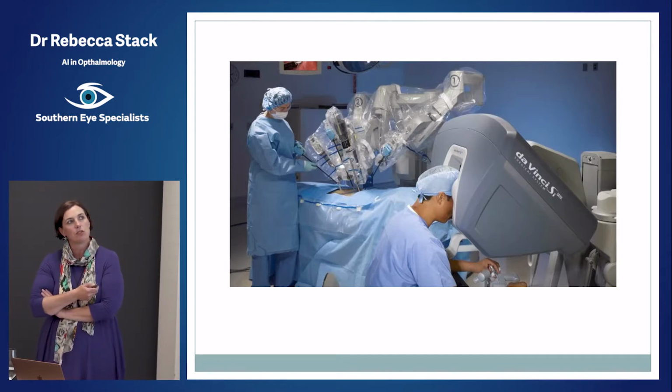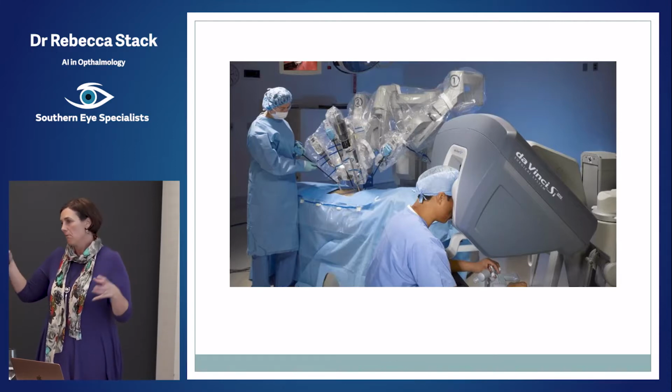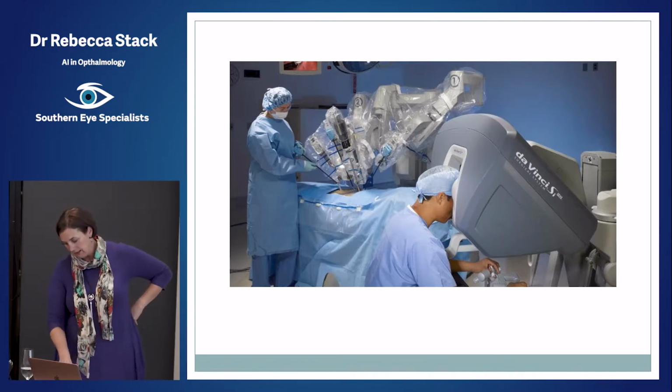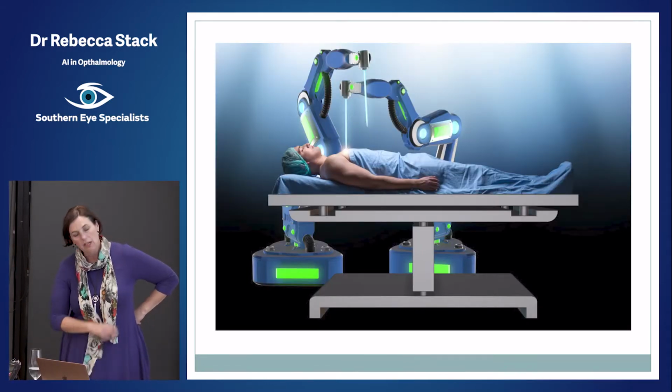This type of robotic surgery is where the surgeon is still in control and still holding on to the pieces or controlling the surgery from afar. Oh, I thought I had another picture in there.